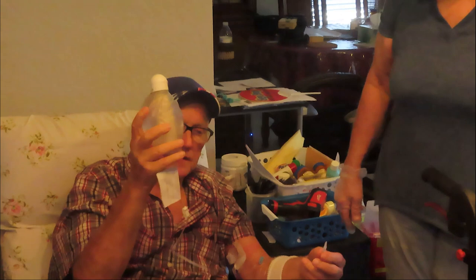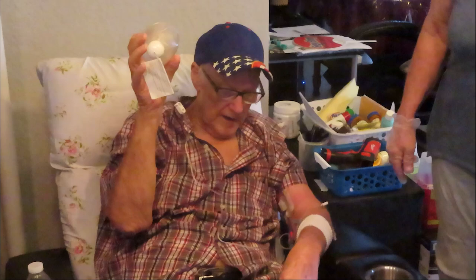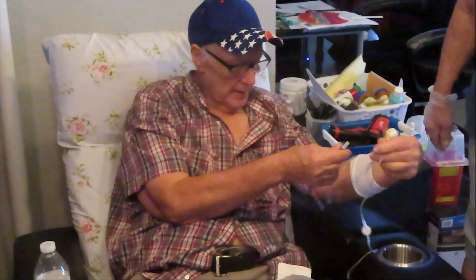Here's my IV. It's a ball, as you can tell. Hose is coming out here. It's got the little shut off here for the hose. And they got a flow regulator, which is here on the bottom. So we're going to hook this up to this PICC line right here, which is there. And so we're going to hook it up to here.